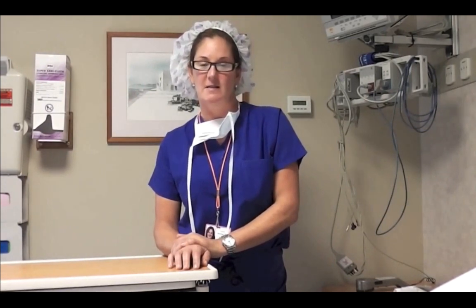Once the patient is positioned properly, we mark out the landmarks, which I'm going to demonstrate later on in this video. We then use ultrasound routinely for all placements of our paravertebral blocks. This block is utilized at Stanford Hospital for breast surgery, for thoracic surgery, and for rib fractures. In fact, this block has replaced epidural catheters for all of those procedures. We've had profound success with this block, particularly for our breast surgery patients, who have a pain-free recovery for the duration of the catheter being in the patient.